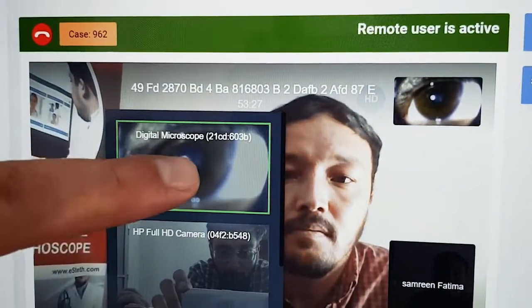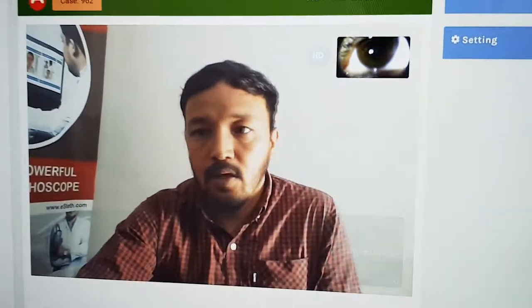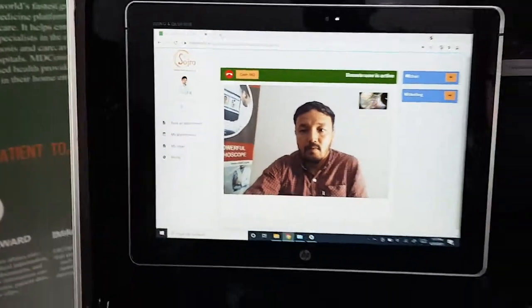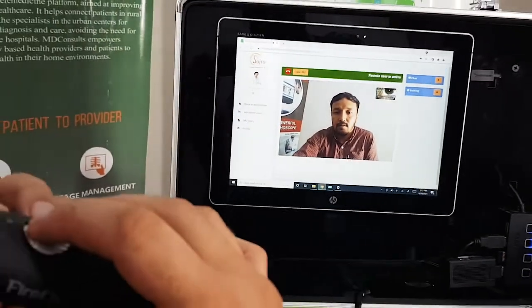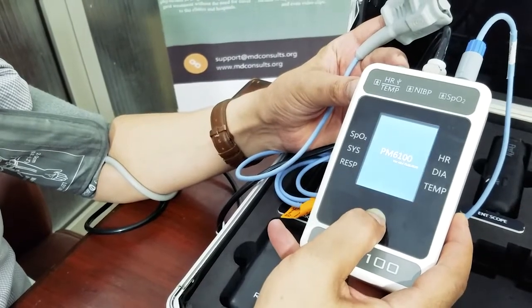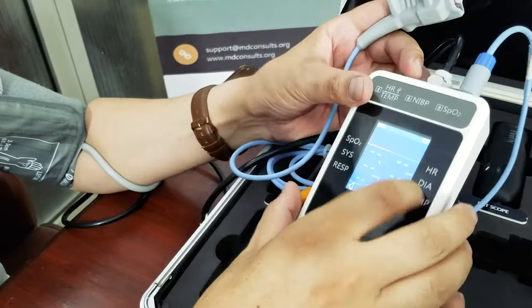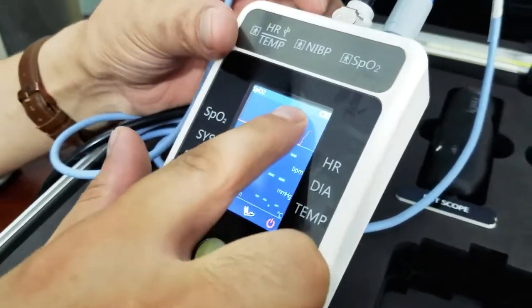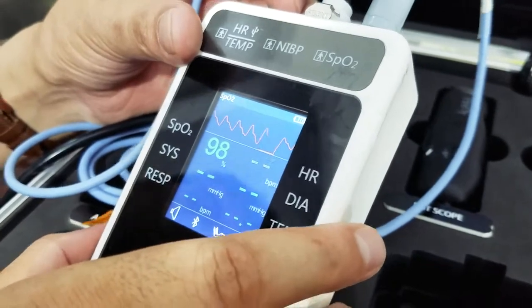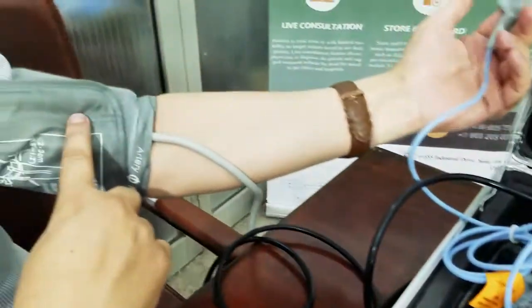You can see that the image will be visible both at the patient and the physician's end. Next, you turn on the vital signs monitor. You can see the blinking Bluetooth sign, which shows that it is connected to the tablet.